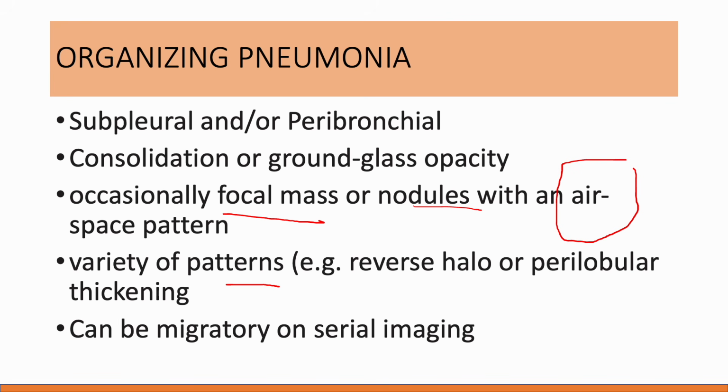One of the classical patterns is the reverse halo appearance and perilobular thickening, but it is not the only pattern that you would expect. Again, it's migratory on serial imaging and classically resolves beautifully to steroids, but may not be the case in all cases, especially secondary ones.